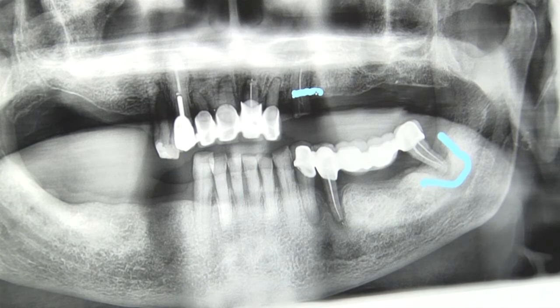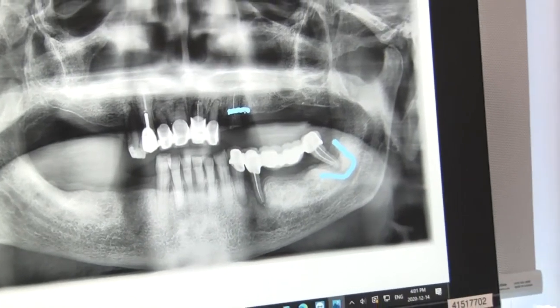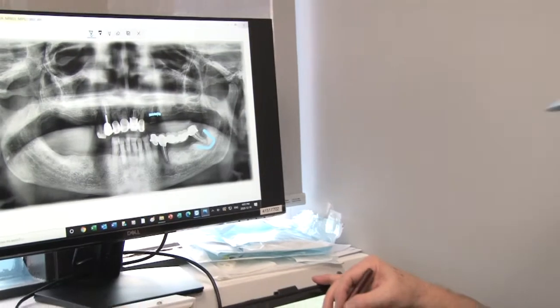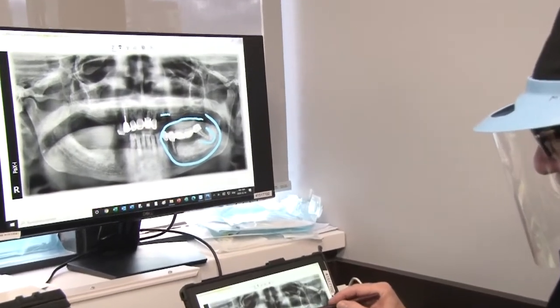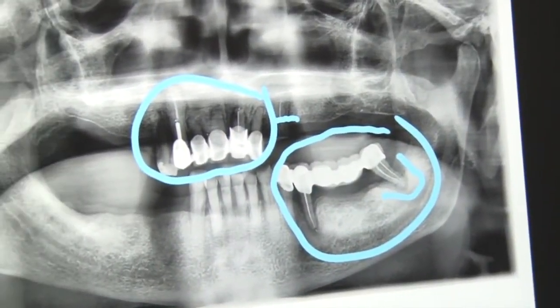I don't want to take out any tooth in her mouth that I don't have to, but where there's rampant infection and or periodontal disease, I have no choice. So in her mouth, I'm going to take out these teeth here. I'm going to leave that one in, and I'm going to take out all of these teeth.